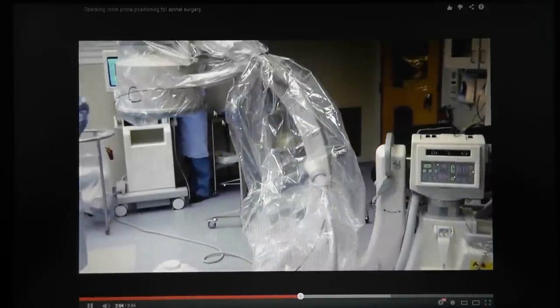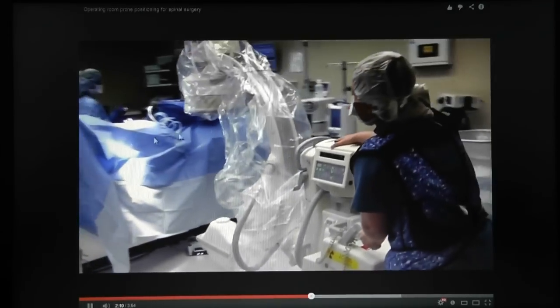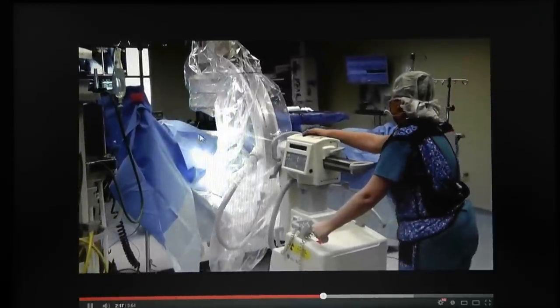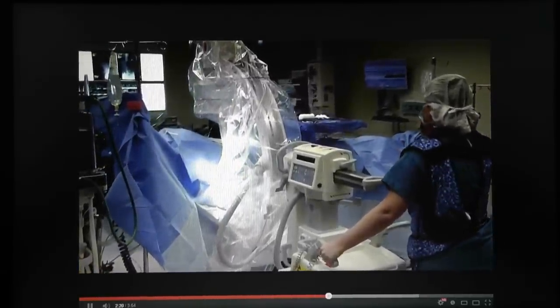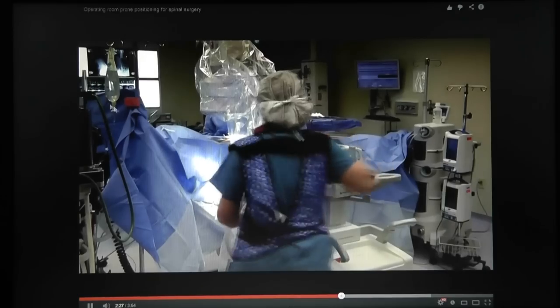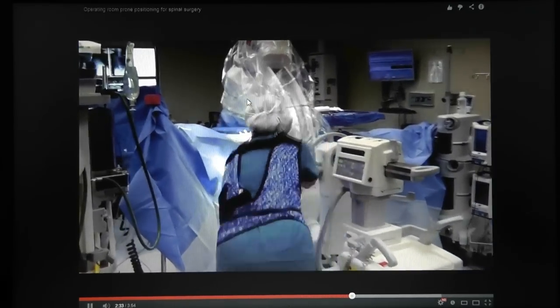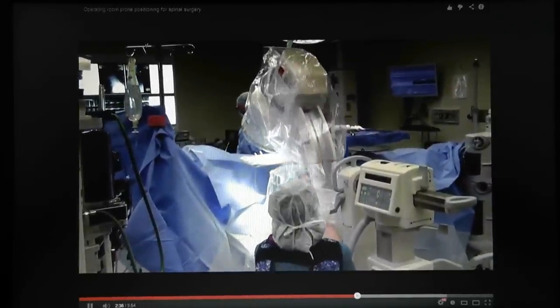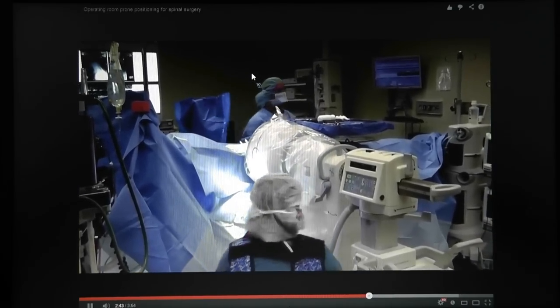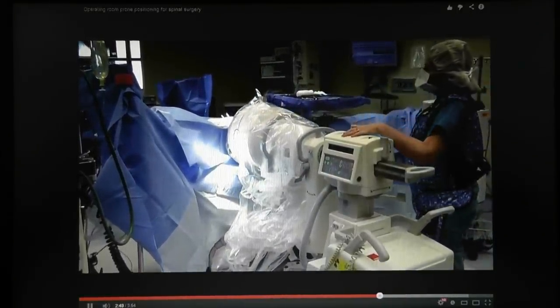During surgery the C-arm is covered with sterile plastic and the patient is draped. I place two small needles in the spine and plan my skin incision, confirming location on X-ray with all the films and MRI scans visible. I always do a lateral view because the sacrum is easy to see and it's the most specific way to understand where you are. The X-ray tech shoots the image and it takes about five to ten minutes pre-op.